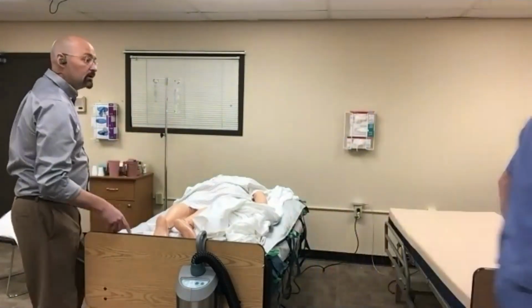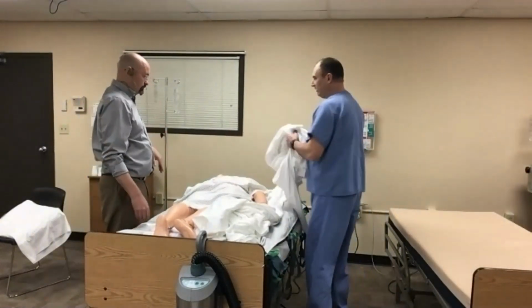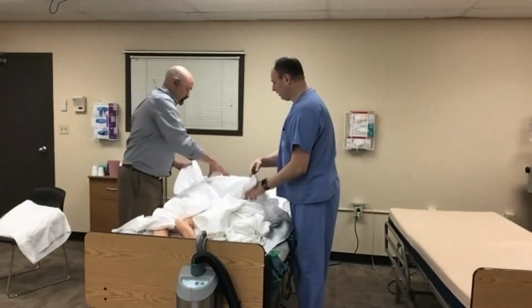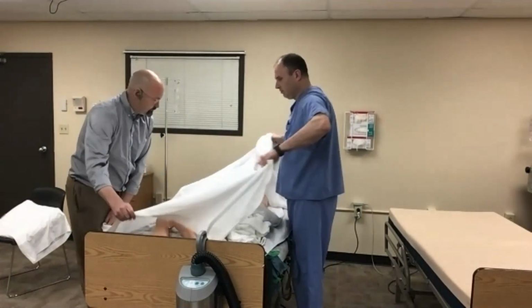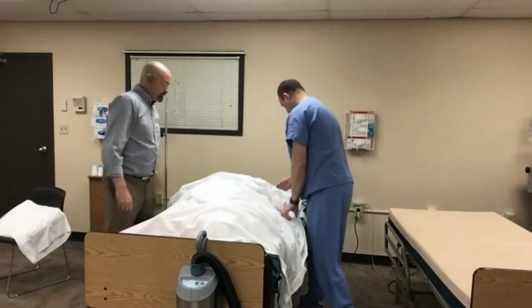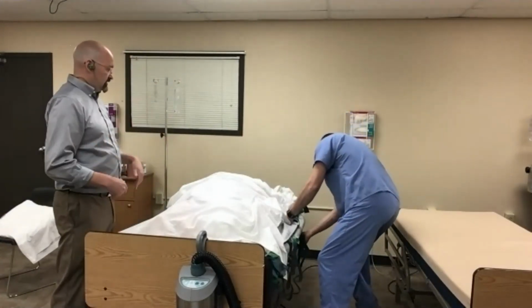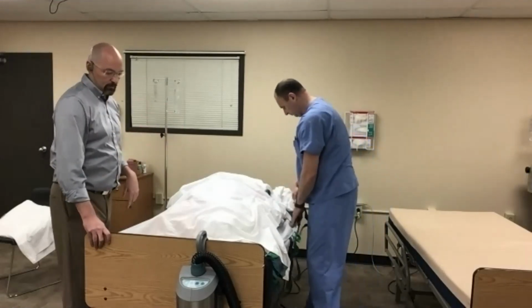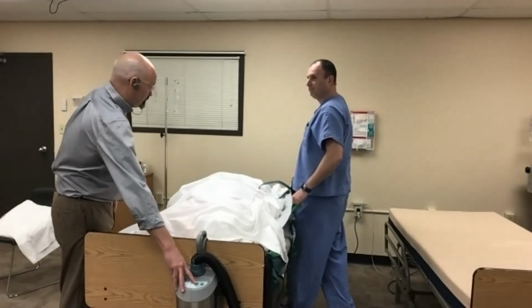My direction? Yep. And we would go top sheet and chuck so that he's got something underneath him. We only have one chuck, so we just put the top sheet. So we're coming toward me again. We're going to come towards you. 1 slide, 2 up, 3 over. Perfect. You ready, sir? Ready? Hot mat. Up now.